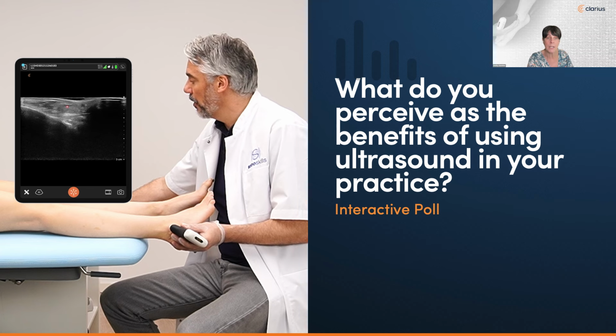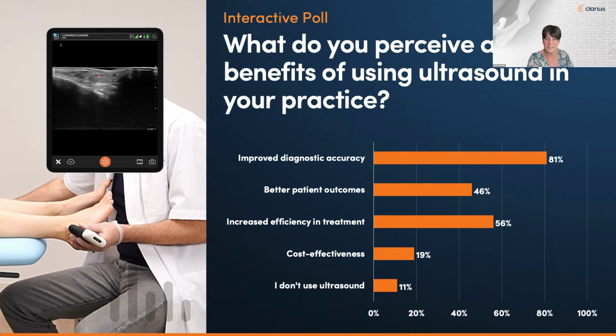Now, just a quick poll before I introduce our guest speaker. What do you perceive as the benefits of using ultrasound in your practice? Now, please choose all that apply. Are you just looking for improved diagnostic accuracy, better patient outcomes, or even if you don't use ultrasound, you can answer that. Let's take a second to close out the poll here. 3, 2, 1. Excellent. Okay, so mostly improved diagnostic accuracy and improved efficiency in treatment. That's great. Okay, so you're going to get some really good information from this webinar.